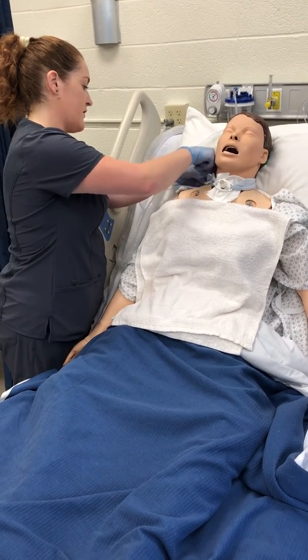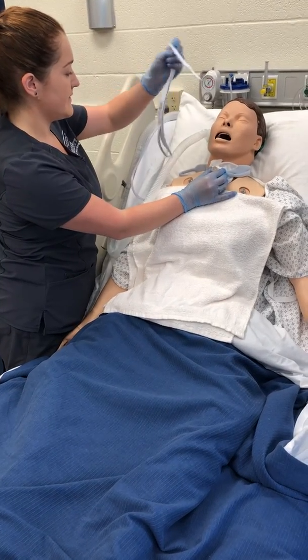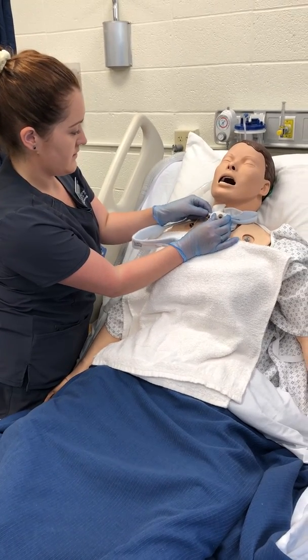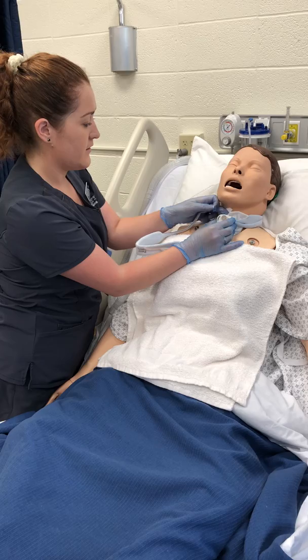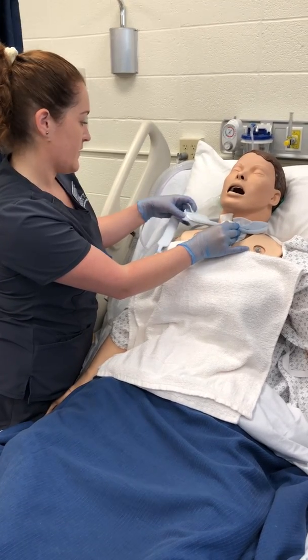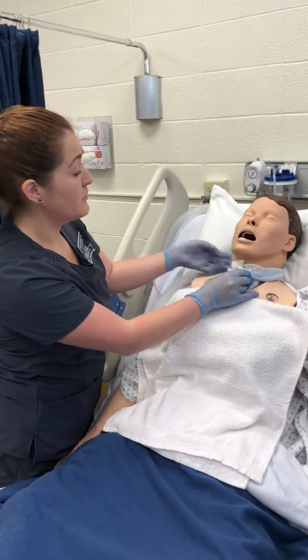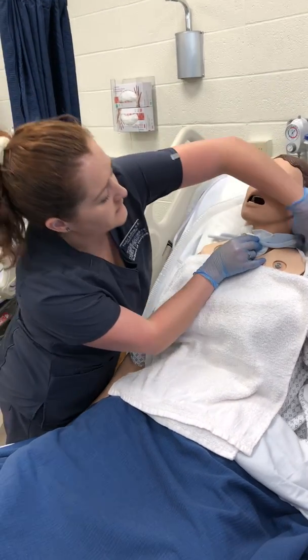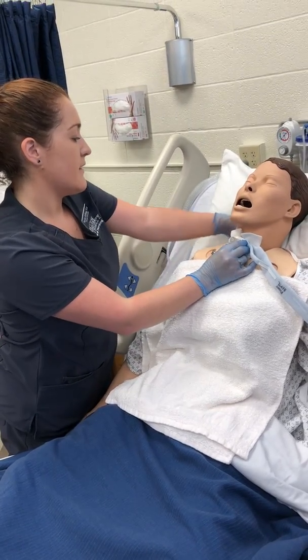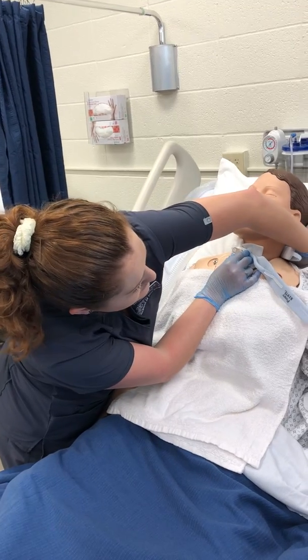John, I'm going to change your ties here real quick. Holding the trach in place, note that I'm only removing one tie at a time — because we do not need John to start coughing and for it to fly out across the room. I'll pull this one out from the other side and tuck this one back behind the neck. You may have him lean forward if he can to assist with that.